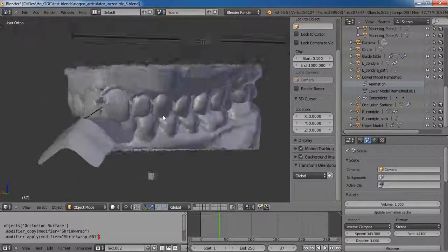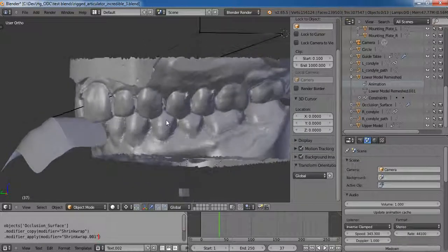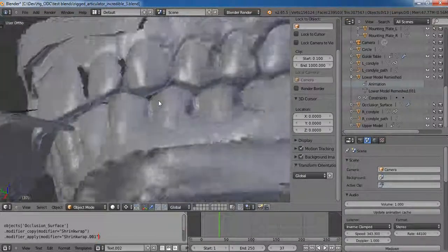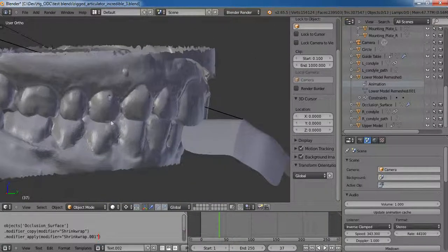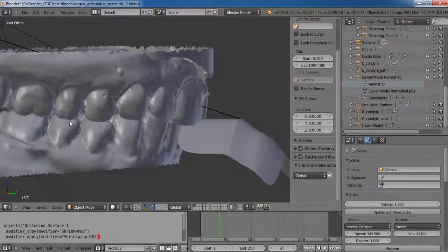But when I was mounting these, I don't think these models were given to me in perfect occlusion. Look over here, you can see we're class 1. We've got a really nice picket fence style fitting here, and there's a good chance that this canine, even though there's space here, probably guides pretty well. You can see this little wear facet, and consequently we don't have any major wear on these premolars. Now over here, we're not as class 1, we're a little more class 2, the canine and the molars being pushed distally. And look at this, sheared off flat cusp tips.